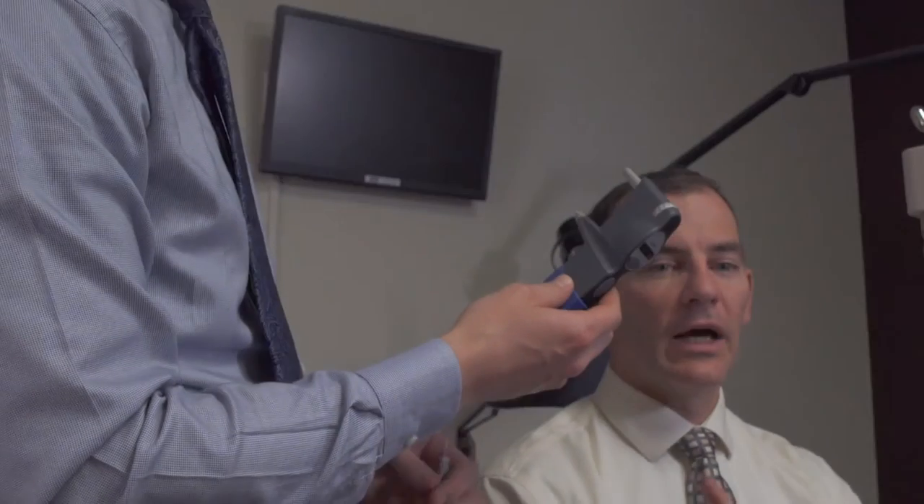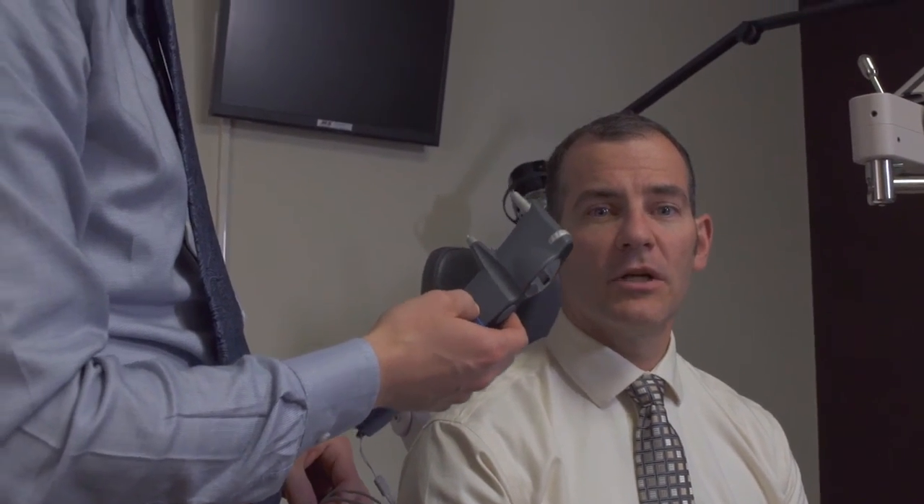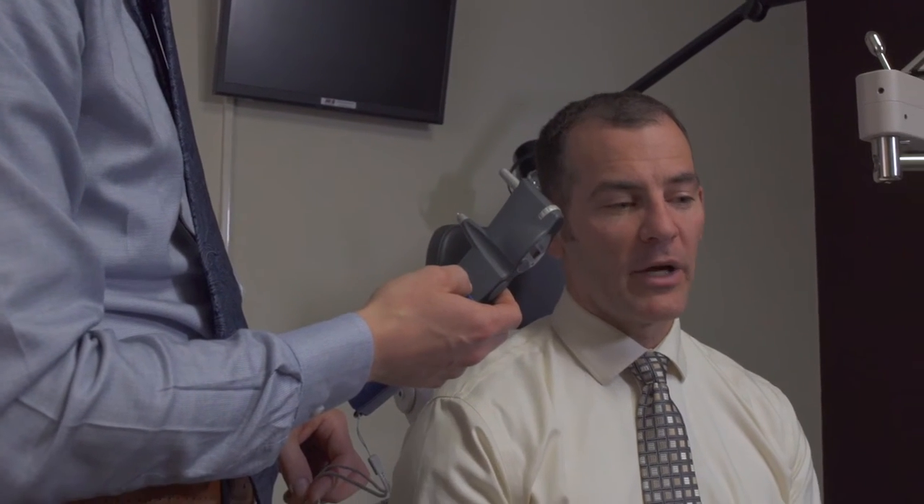The iCare tonometer does not require numbing the patient's eyes, which as a cornea specialist I find particularly helpful — if my technician checks the eye pressure I can still subsequently check the corneal sensation, whereas if they were to use the Goldman or the Tonopen I would not be able to check corneal sensation later in the exam.